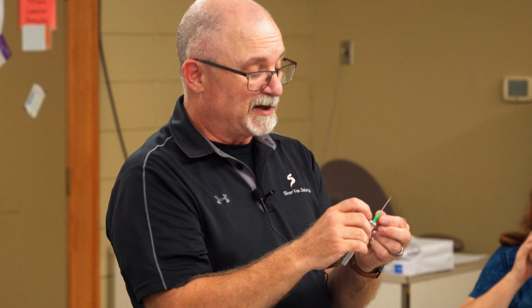Okay, so here's your IV catheters, Gelco, whatever variation on the theme, but it's got a safety, its own sharps kind of piece. It's not 100%, but it draws back into there. So I'm going to take this off. There's the rest of your stuff. And I have not played with the spring loaded, so this is going to be fun. I have, it's just been a while.